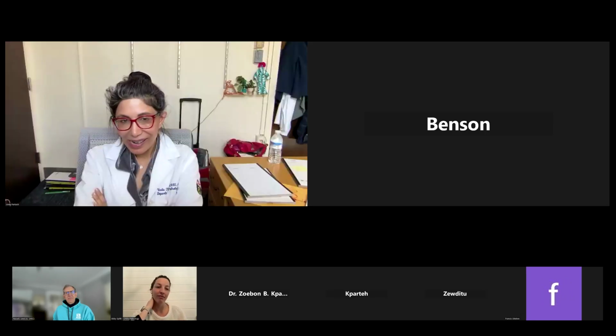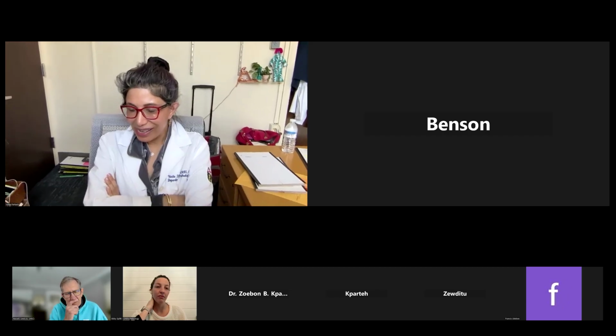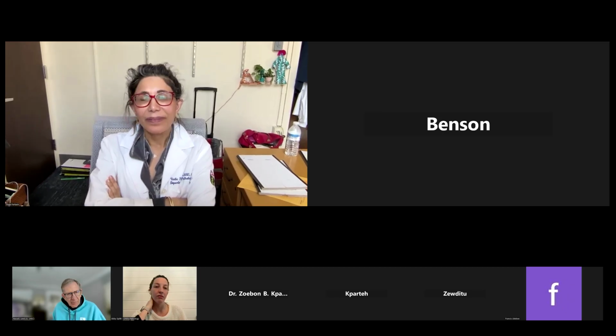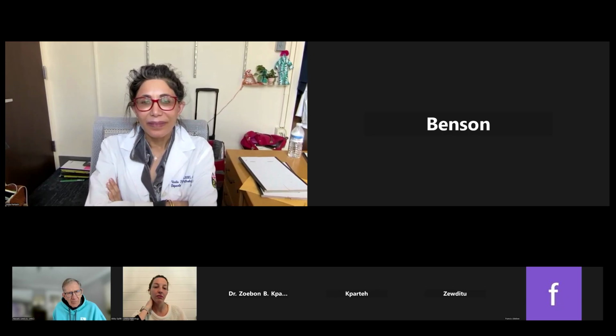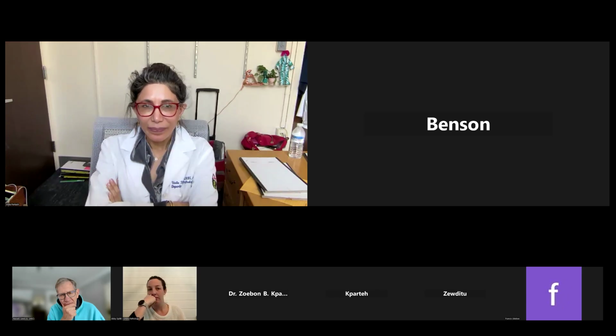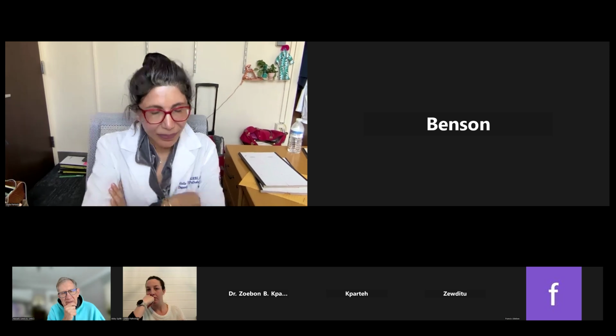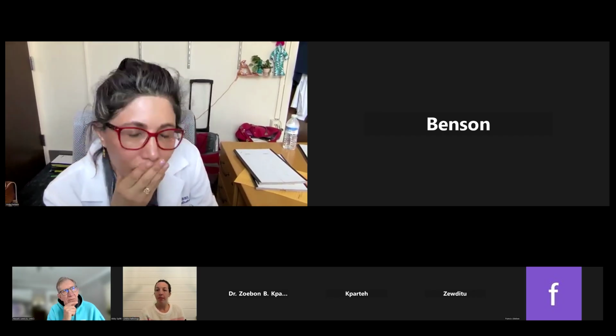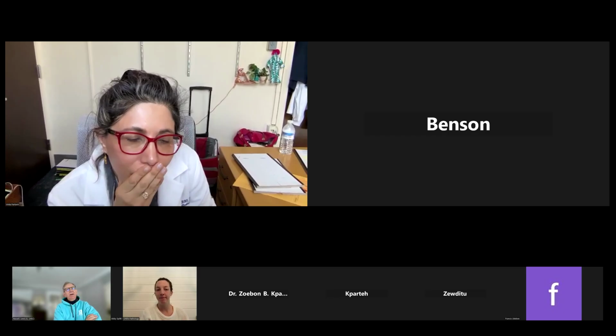Sorry, I've joined while driving, but I have a case that I've just reported right now, an adult granulosa cell tumor in one ovary, while in the other ovary we are seeing an endometrioid type adenocarcinoma, and this is replicated within the omentum.